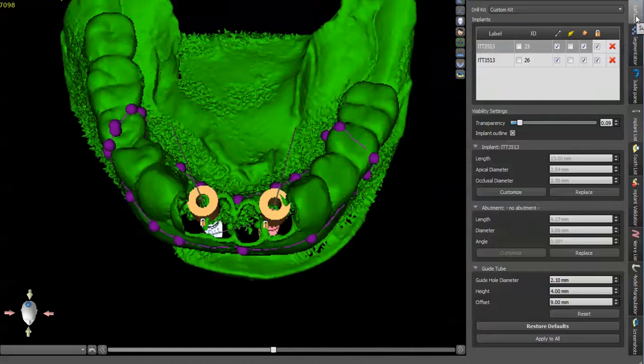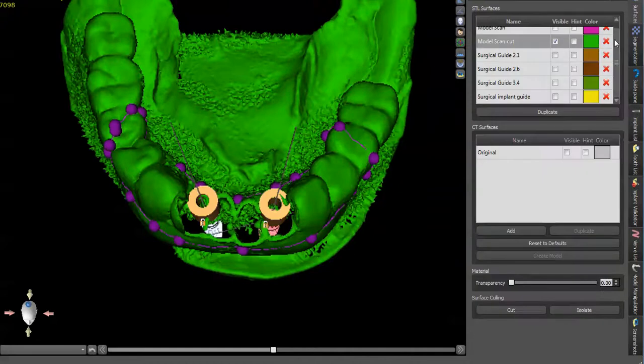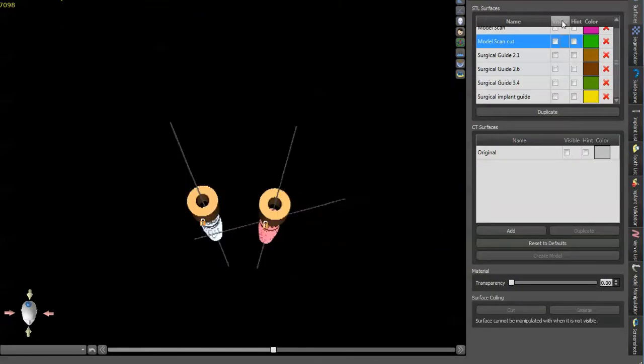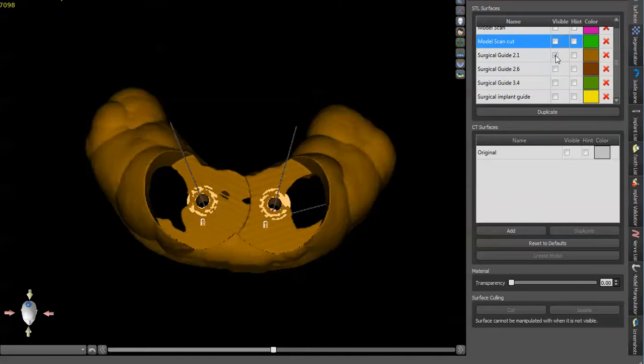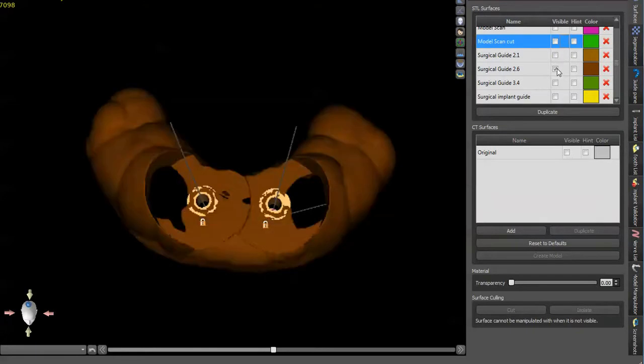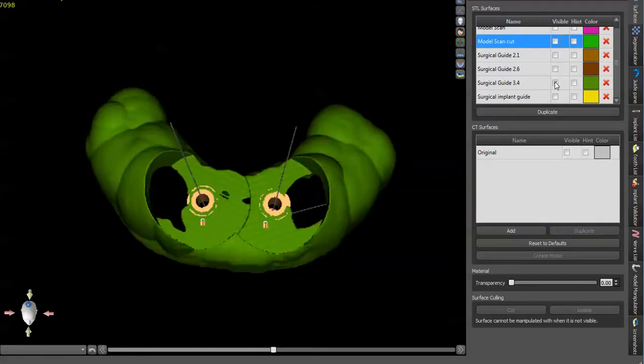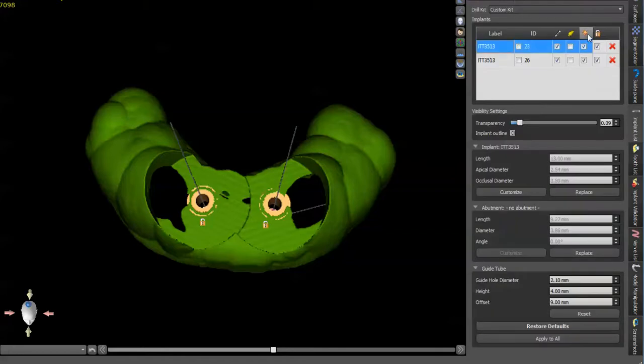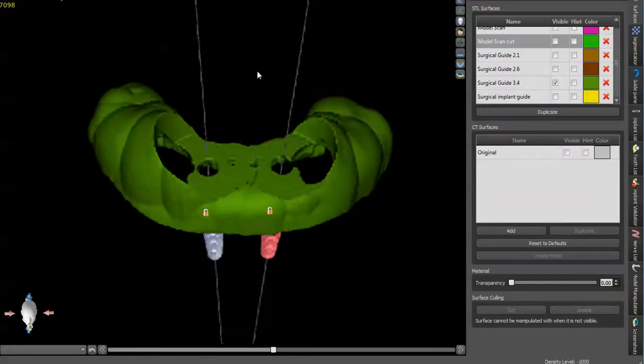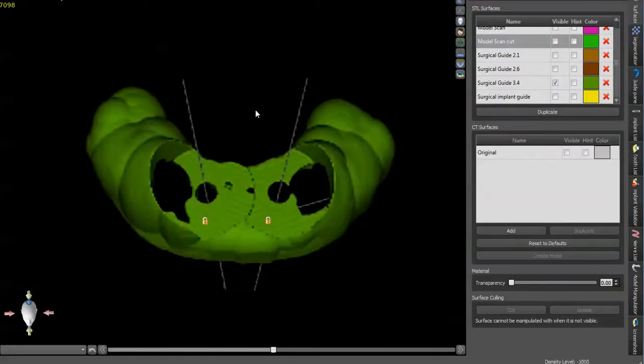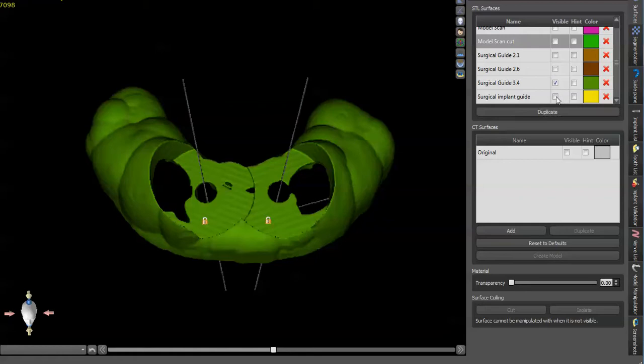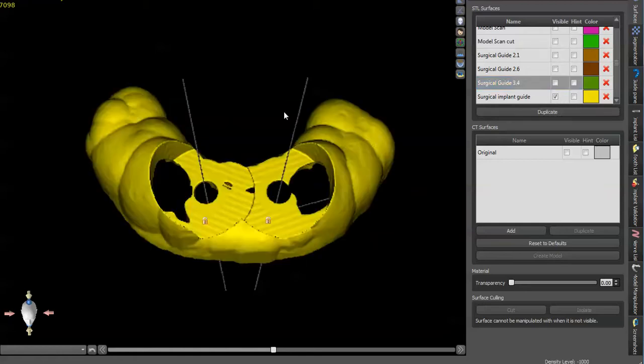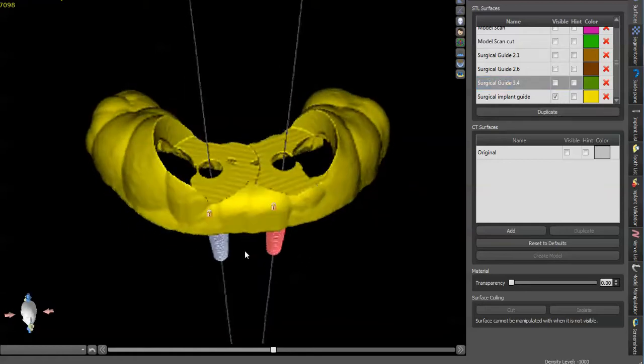So if we go into our surfaces, I'll click off of everything. And if I want a pilot drill guide, I can make this and then use sequential drill guides for each. Let me turn these guys off.